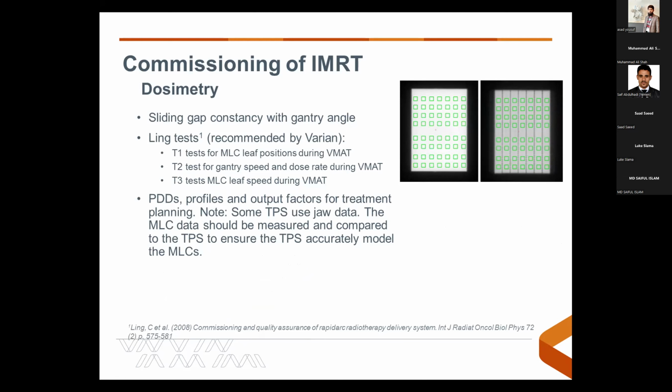We also do Ling tests. These are recommended by Varian for RapidArc commissioning, and this is from the paper down here. There are 3 different tests. There's a T1 test, which tests for MLC leaf positions during VMAT.